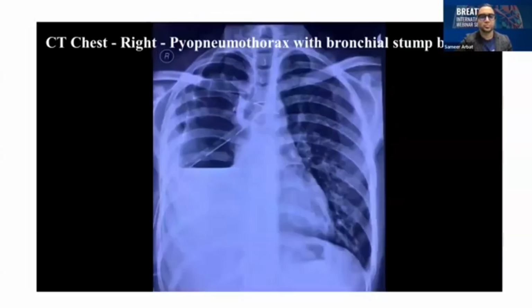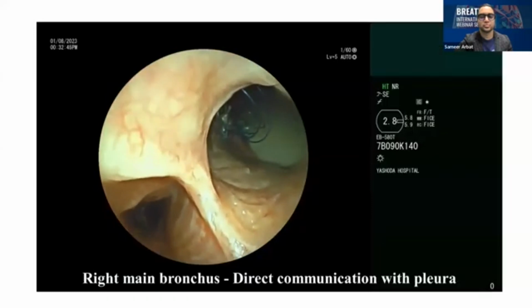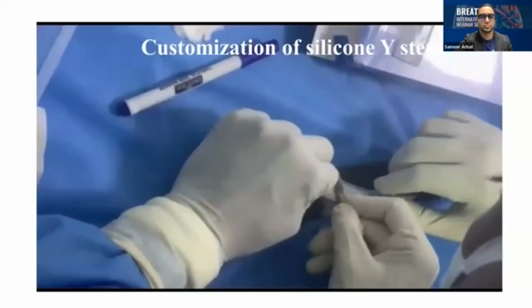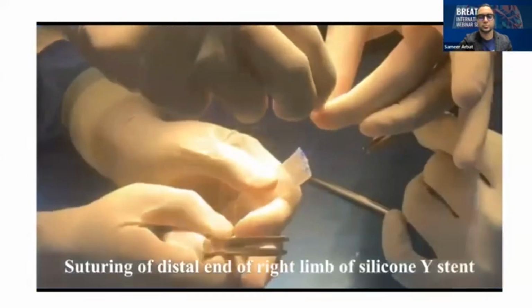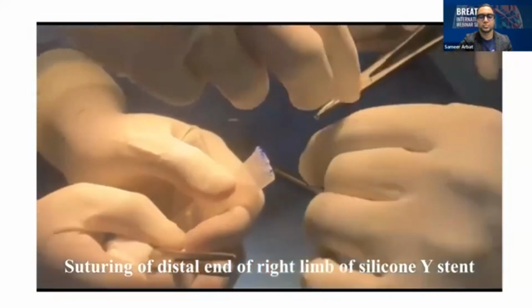Apart from that, this is yet another interesting case where there was a post-pneumonectomy stump blowout secondary to mucormycosis, and you can see there is no bronchial limb left, and there is an ICD which can be visualized through the infected pleura. So to prevent aspiration of the contents from the infected pleura into the normal lung, we wanted to place a modified silicone Y stent.